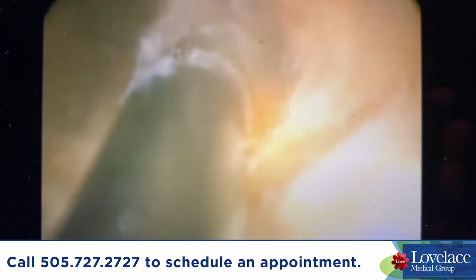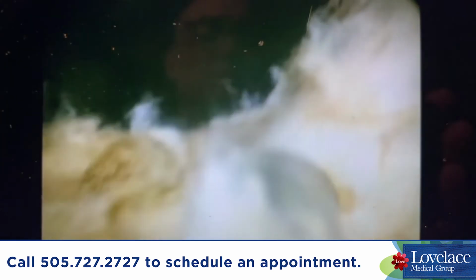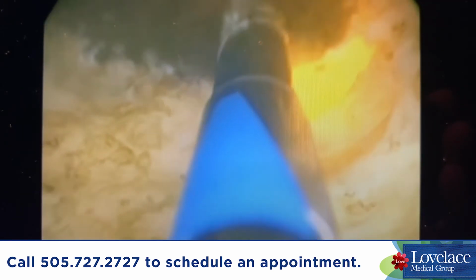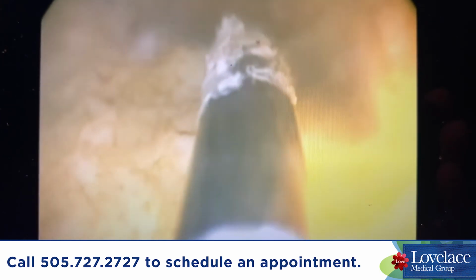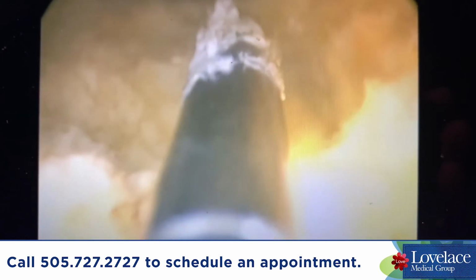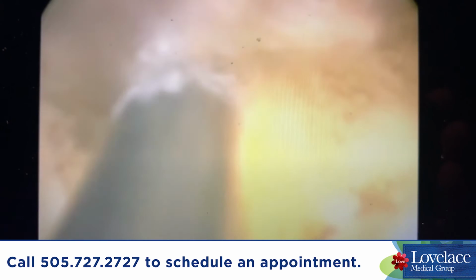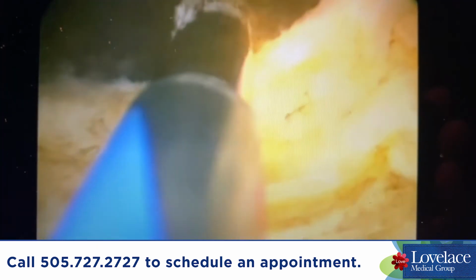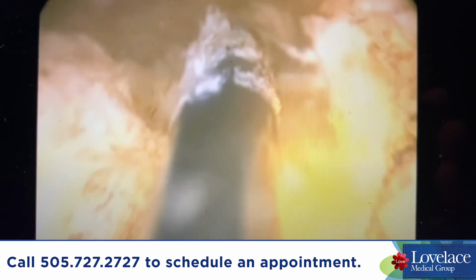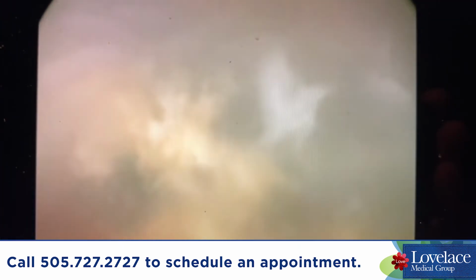So what we're looking at in this picture is actually using this laser to cut through the tissue. You can see it's relatively bloodless, and you can shell out the inside of the prostate into left and right lateral lobes and a large median lobe, and extract this tissue at the end of the case. Less energy is transferred to the patient. Healing time is better. So what was once a very extensive operation requiring a lot of recovery can be done on these larger prostates, upwards of above 100 grams, even above 200 grams, and minimize hospitalization time, catheterization, blood loss, and recovery.